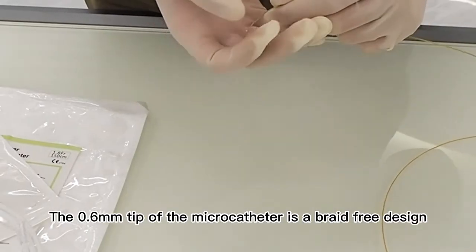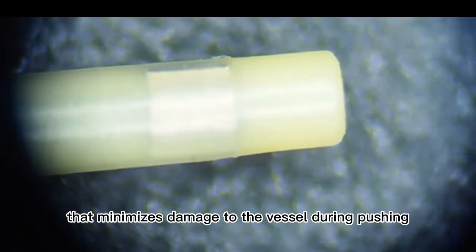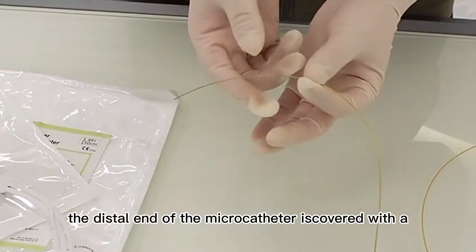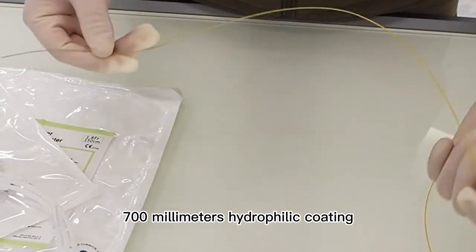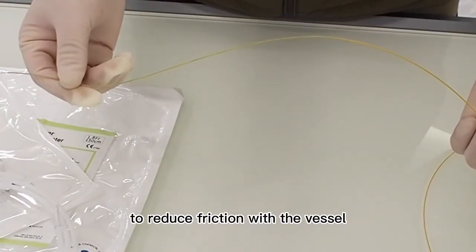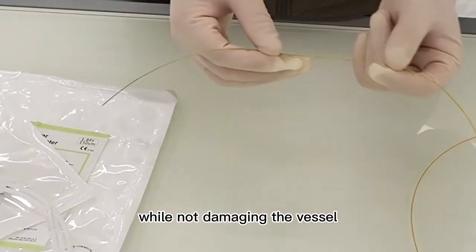The 0.6mm tip of the microcatheter is a braid-free design that minimizes damage to the vessel during pushing. The distal end of the microcatheter is covered with a 700mm hydrophilic coating to reduce friction with the vessel and to facilitate pushing of the microcatheter while not damaging the vessel.